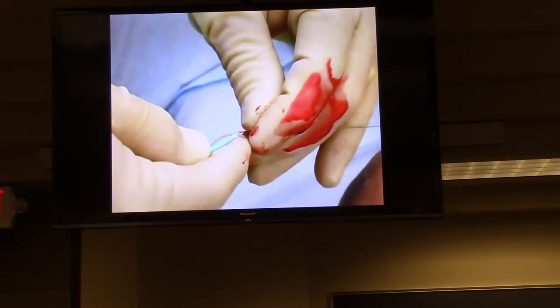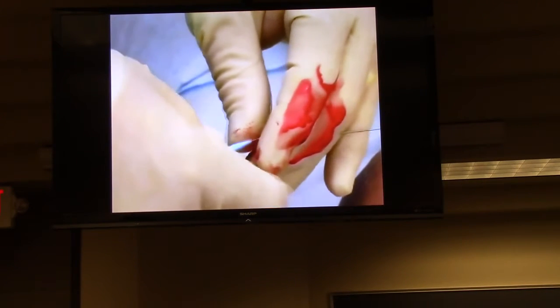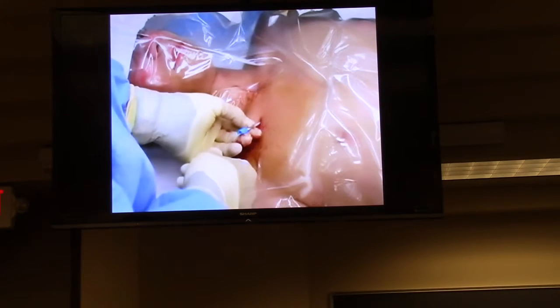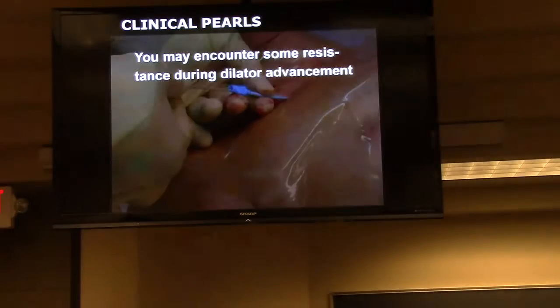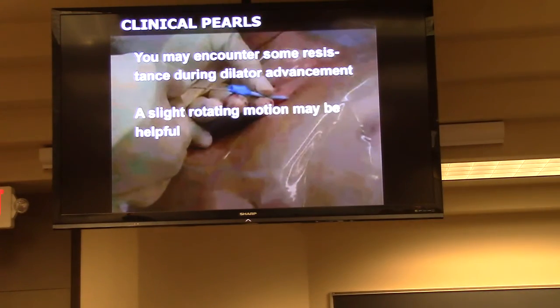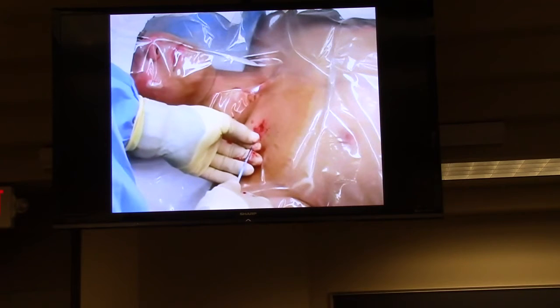Hold the very tips of the dilator and the guide wire to steady them, and advance the dilator over the wire. Advance the dilator through the skin and into the vessel. Again, make sure that you always have a firm grip on the wire at all times. You may encounter some resistance during dilator advancement. A slight rotating motion may be helpful. You may now remove the dilator, leaving the guide wire in the vessel.